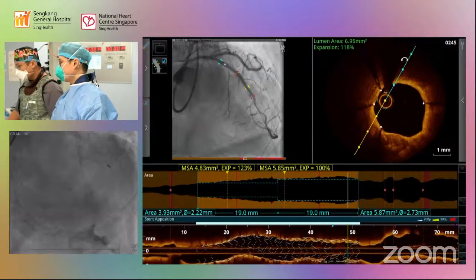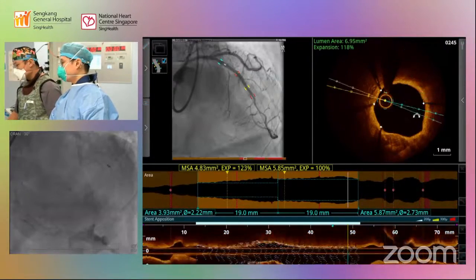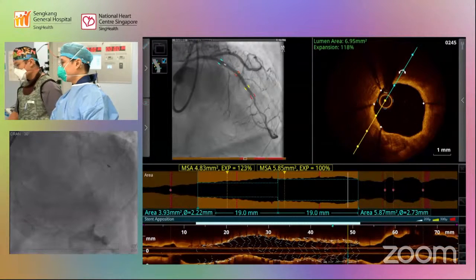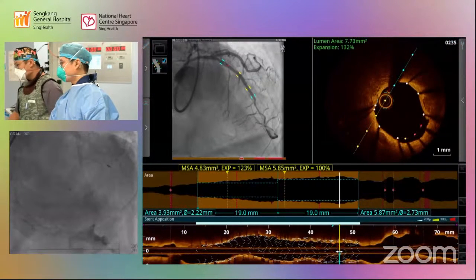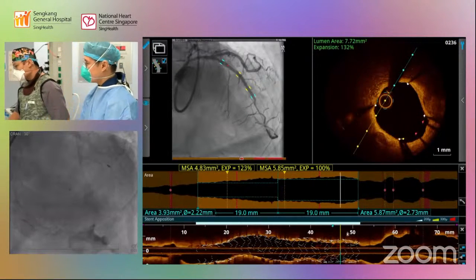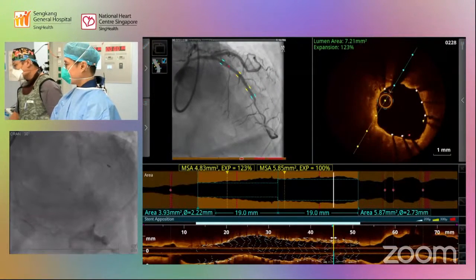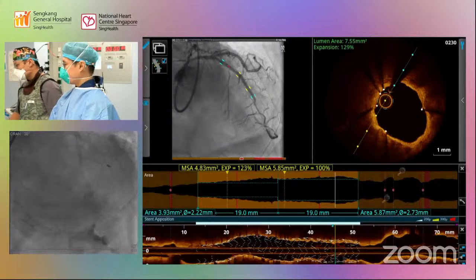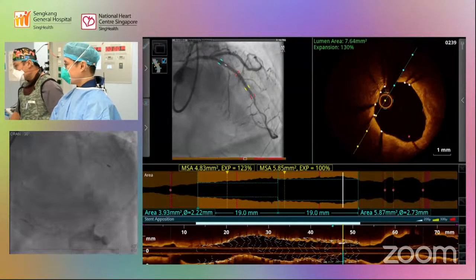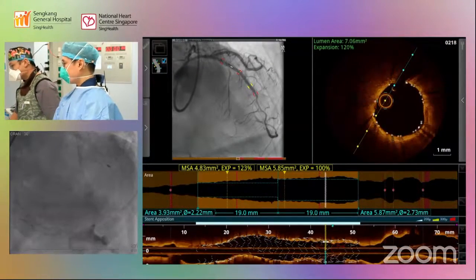You can turn the stent around to see where the dots are more concentrated. So we come to this area over here. Because the vessel or the lumen is eccentric, there are some areas where there is a bit of malapposition between the stent struts and the vessel wall. Again, not large amounts, just restricted to that one little quadrant over there. I personally think this is probably okay to leave, but we can see what the rest of the panelists think.